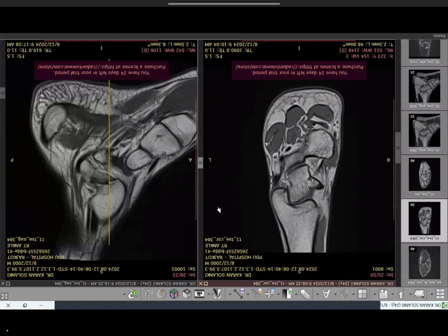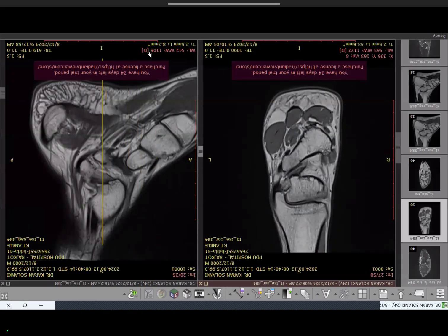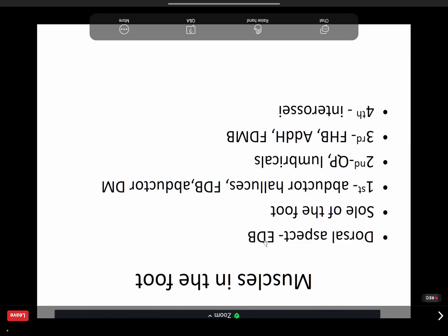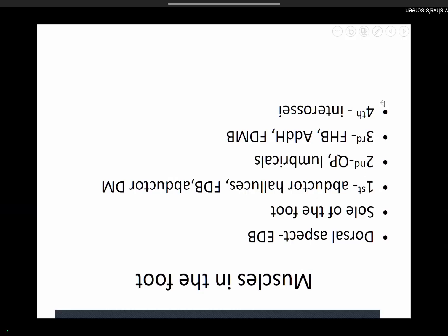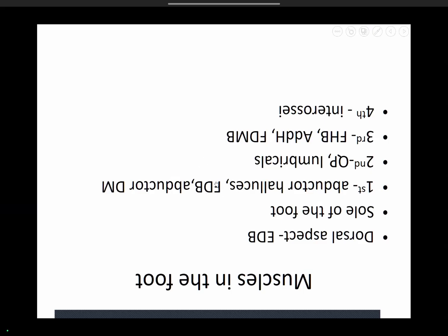Now to the foot muscle anatomy — we'll cover the PPT briefly before showing the DICOM. On the extensor aspect of the foot there is just one important muscle: extensor digitorum brevis. In the sole of the foot there are four layers. First layer: abductor hallucis medially, flexor digitorum brevis as the central large muscle, and abductor digiti minimi laterally. Second layer: quadratus plantae and the lumbricals. Third layer: flexor hallucis brevis, adductor hallucis, and flexor digiti minimi brevis.